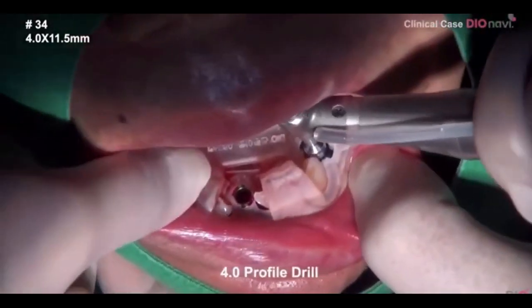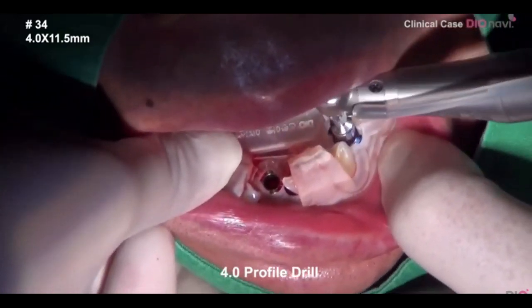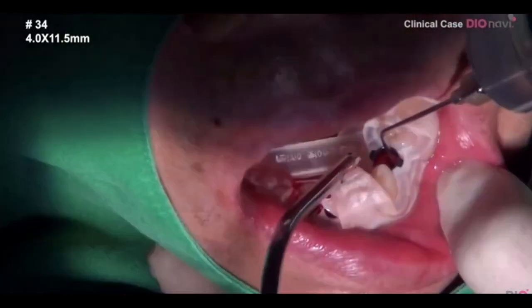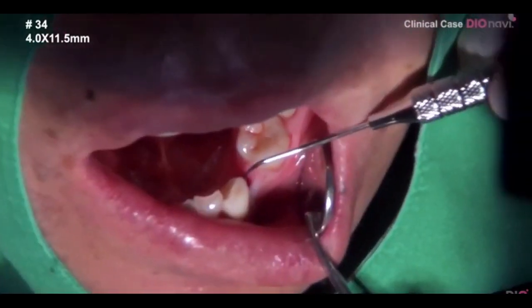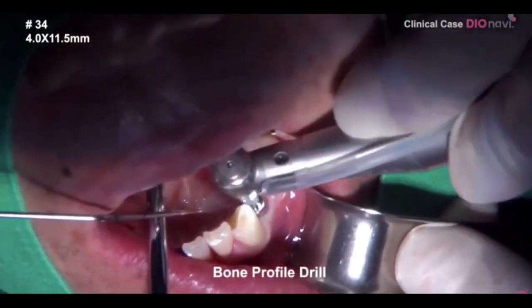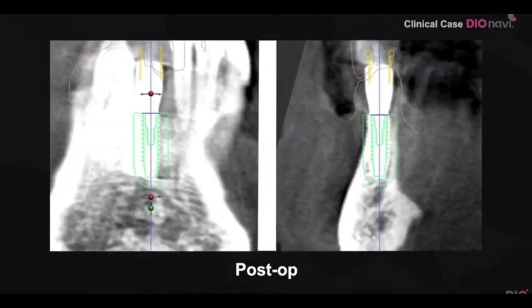Now this is the part where the fixture is placed. This is the bone profile drill. This removes some of the bone. The fixture goes in and the prosthesis is placed. You can see that the implant is placed in the same location as it was planned.